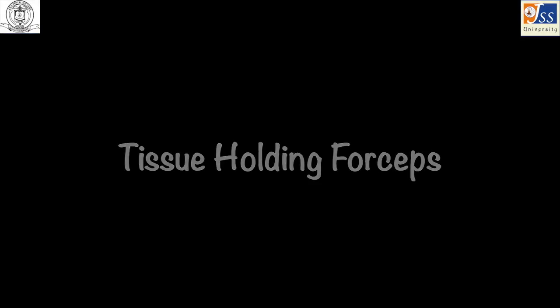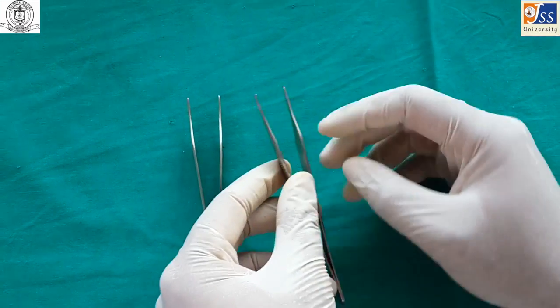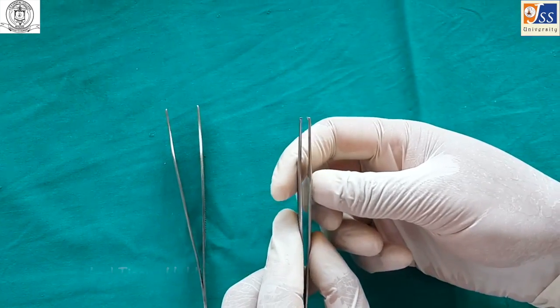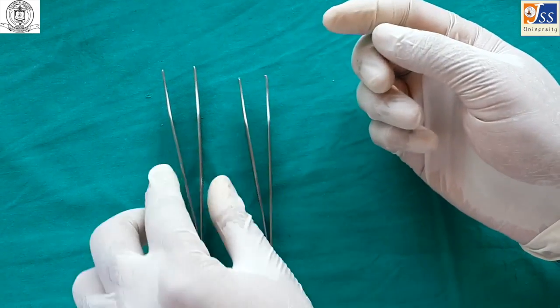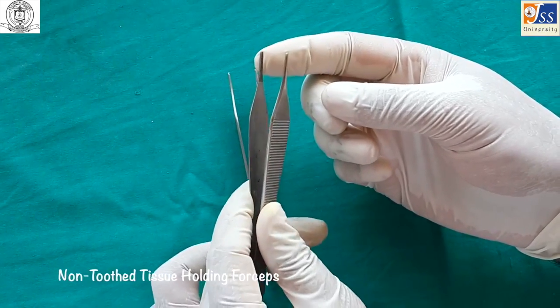Tissue holding forceps is used to grasp tissue during minor oral surgeries and suturing. It comes in two variants: toothed tissue holding forceps and non-toothed tissue holding forceps, the latter being used for holding delicate tissues.